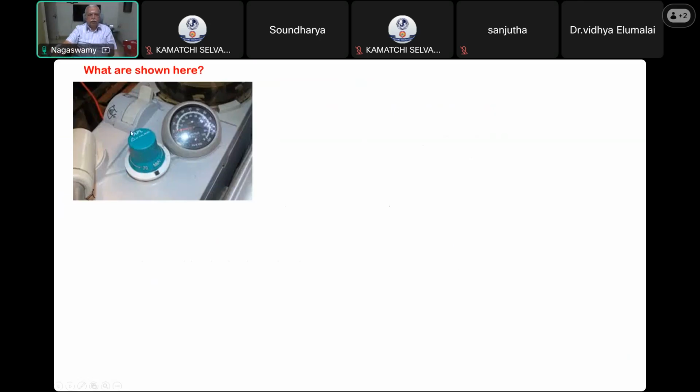APL, what is the expansion? Adjusting pressure. Pressure limiting. Adjustable pressure limiting valve. So that is adjustable pressure limiting valve, and it is minimum to maximum 70. This is a number, because they may suddenly ask you what is the minimum. Is it 0? There is no 0 here. It is written MIN, minimum to maximum 70 unit here.